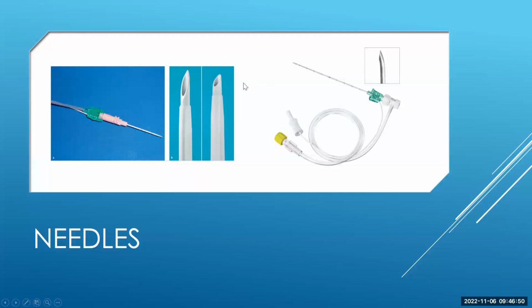This image is again highlighting the various needle types and bevels, and you can see the insulation stops here and here, so there's going to be stimulation all through this area. It's still pretty good. You can see the short bevel needle versus the longer one, which is more likely to pierce a nerve, if you will.